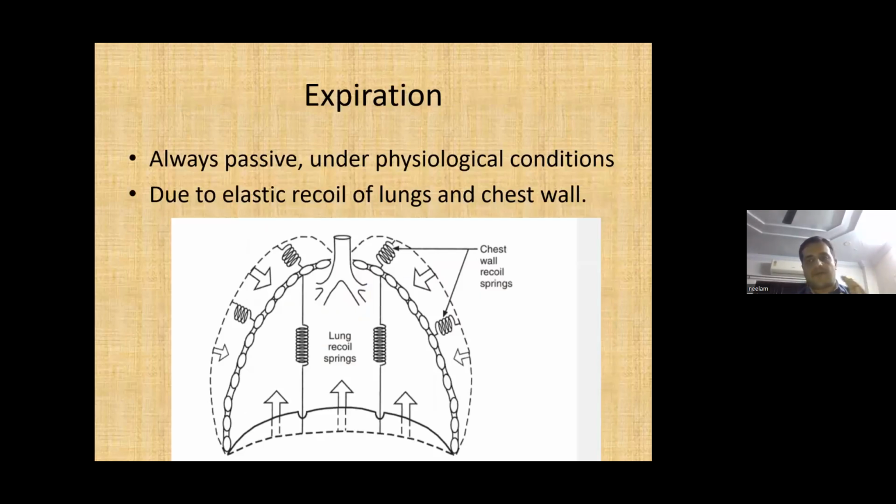Okay, so till now what I told is that inspiration is actually an active process. For that we need to create some pressure difference. Expiration by and large is always passive. Even when the child is on mechanical ventilator, in most of the cases the expiration is passive. In normal tidal breathing also the expiration is passive. If the child is on mechanical ventilator also the expiration is passive. Only one situation where the expiration is active is when the child is on high frequency ventilator. Other than that, in almost all the scenarios, the expiration phase is a passive phase.